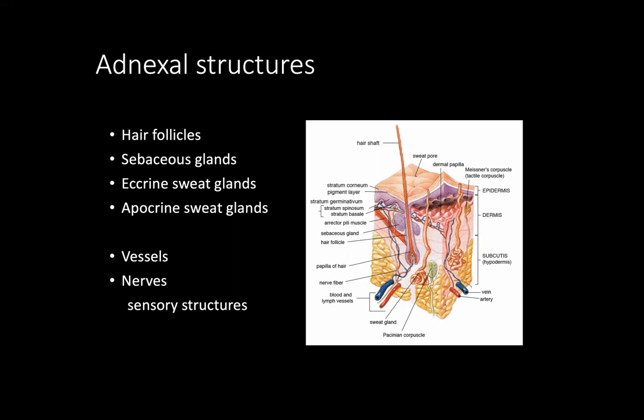Vessels are located all throughout the skin. You've got really small vessels in the superficial dermis, and as you go into the subcutis, they usually get much larger. You can have arteries and veins deeper down that transition into arterioles and venules, and you, of course, have capillaries as well. And think about vascular proliferations. You might have hemangiomas that are mostly arteriole based, some that are mostly capillary based, some that are mostly venule or venous based, and you may have some that are lymphatic based.